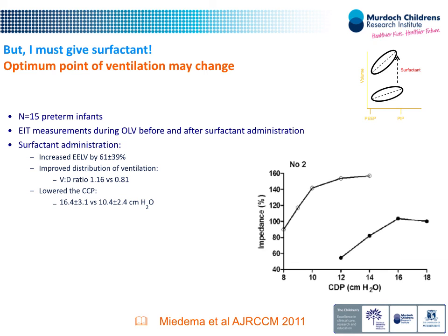And what happens here is that now the closing pressure of the lung may be different, and all that work you've done has changed. So as we discussed earlier, what do I do here? Well, if the baby has got better, then you would wean the mean, because you'd expect the baby to need a lower mean. You've given surfactant, it's a good thing to do.